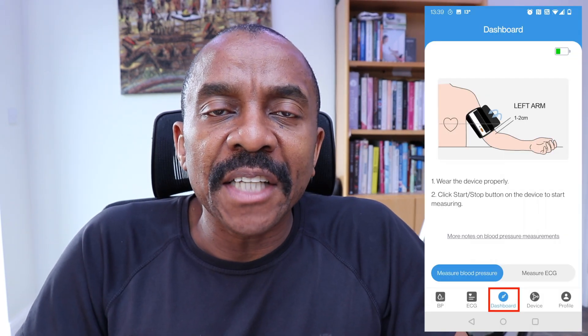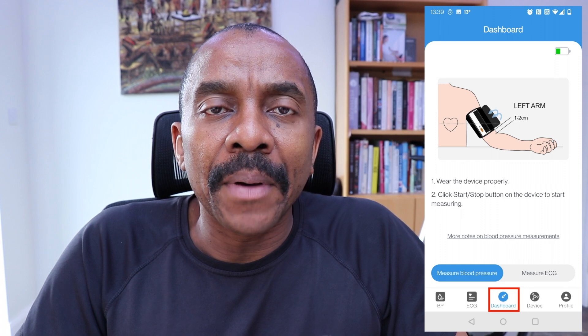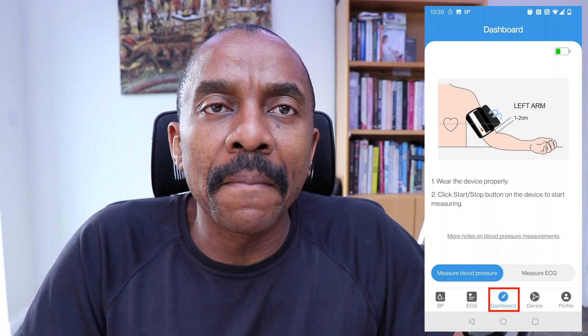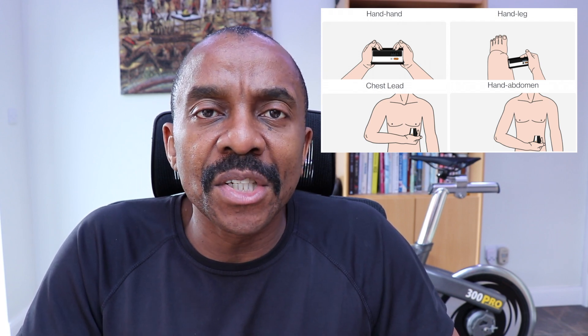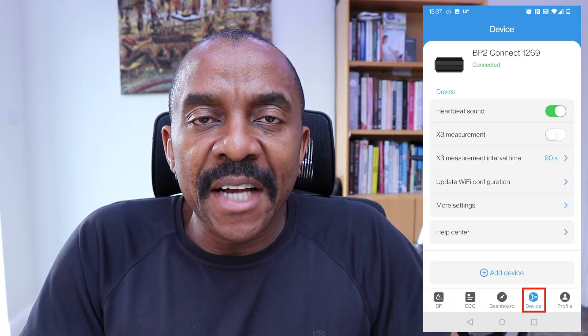As you can see, it's very easy to assign someone's name to a particular reading, which makes it a lot easier to use. When you tap on the dashboard icon on the app, it will display how best to take your blood pressure reading. If you select measure ECG, it would display the four screens in which you can take an ECG reading, one of which I previously demonstrated.